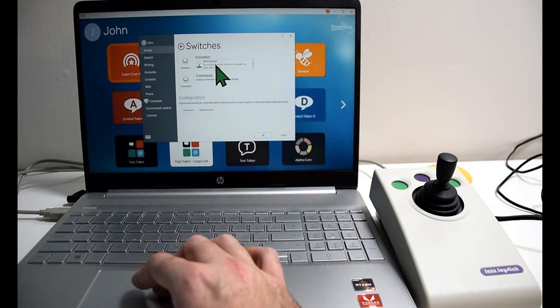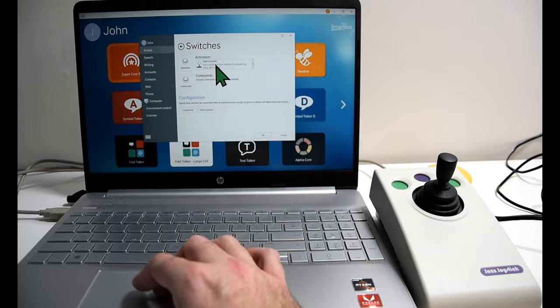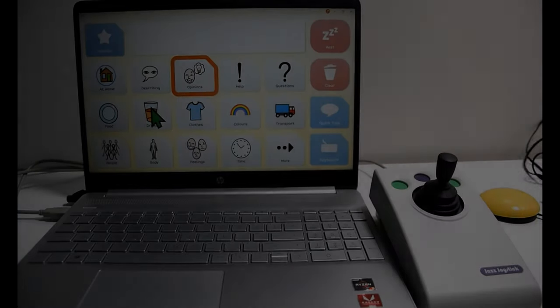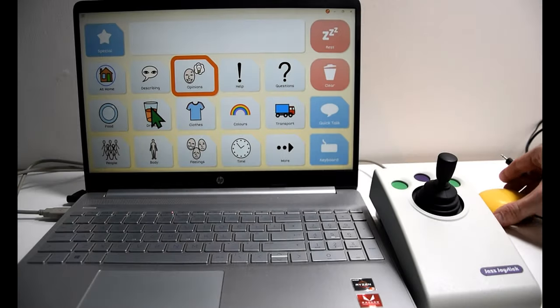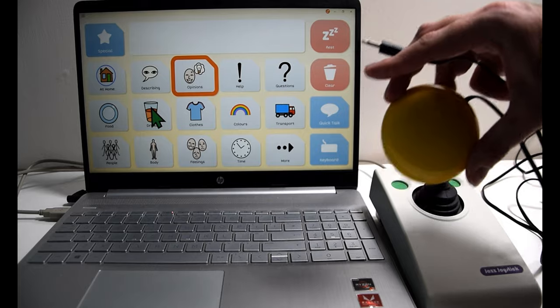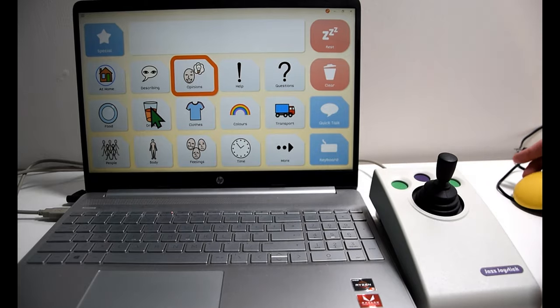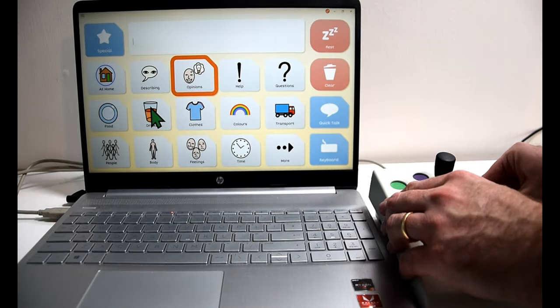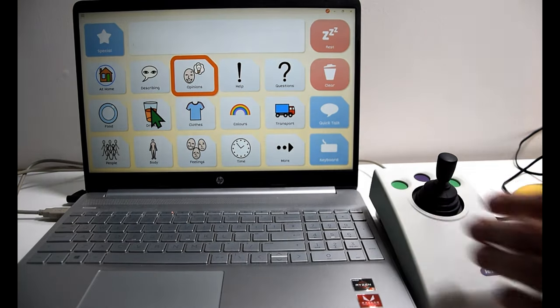Okay, so I've got one of our Smoothie yellow switches here. I'm going to plug it straight into the side of the Jazz joystick.